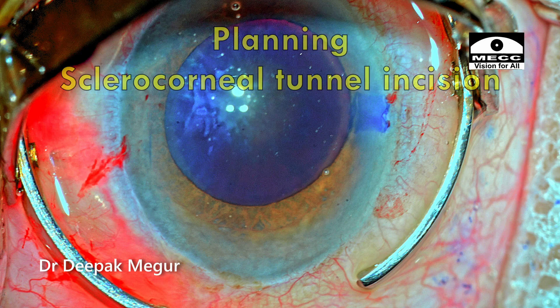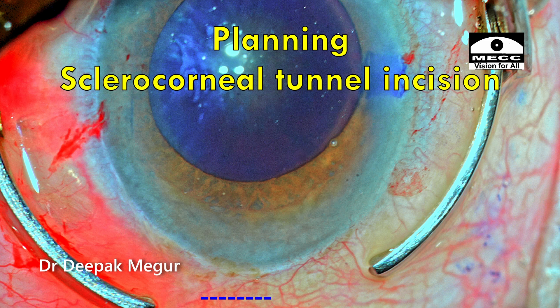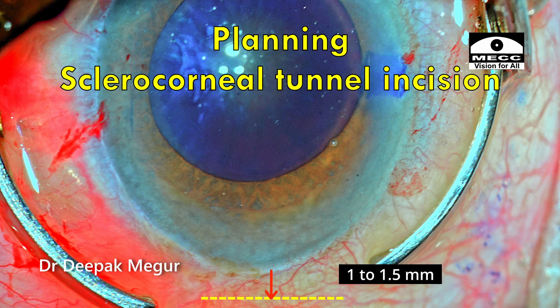I'm intentionally planning a sclerocorneal incision here. A scleral groove is created through the conjunctiva about 1 to 1.5 mm posterior to the limbus. Then I'm using a 2.8 mm sharp keratome to first create a small sclerocorneal tunnel before entering the anterior chamber about 1 mm anterior to the limbus. The idea is that wound burn will be minimal, if it happens at all — although it's rare when using torsional energy.